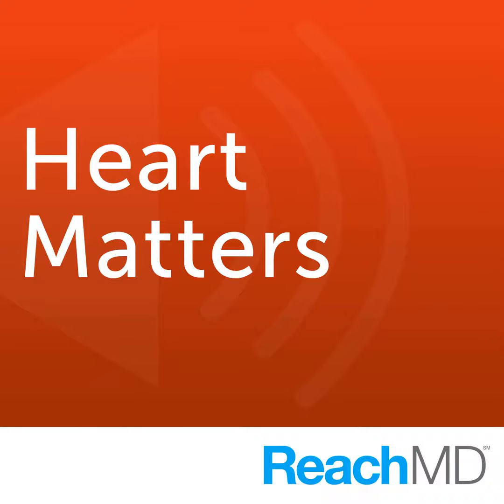So the big thing to say about these is that right now, coronary calcium measurement is done really in a person who's asymptomatic, looking at adding a little bit more information about their risk. This has been a somewhat controversial test because it's more expensive and it involves exposing the patient to radiation. But there is a lot of evidence that it provides some information about prognosis, and there's some feeling that in someone who has intermediate risk and you're on the fence about whether to start drug therapy like a statin or not, the information may prove to be useful.